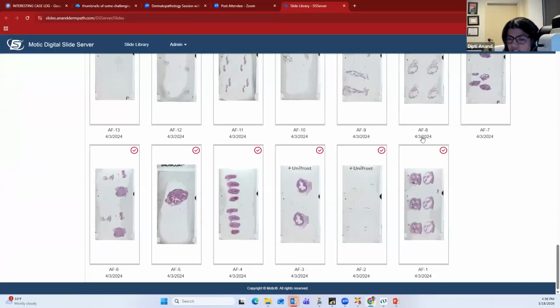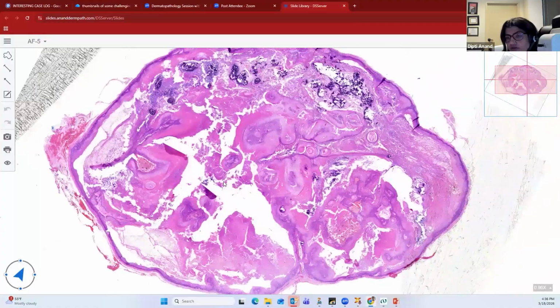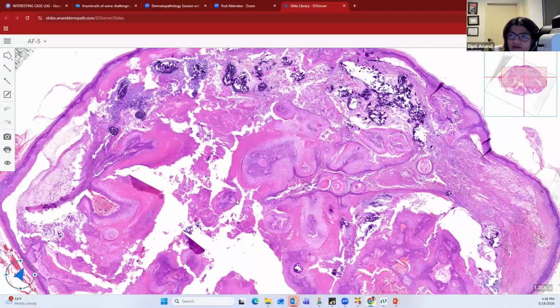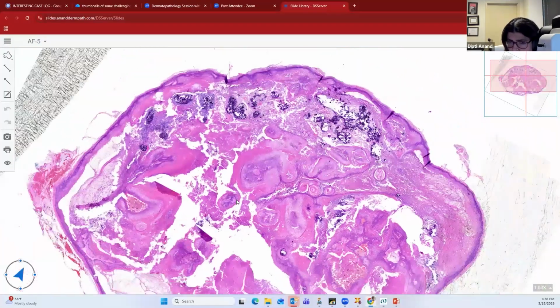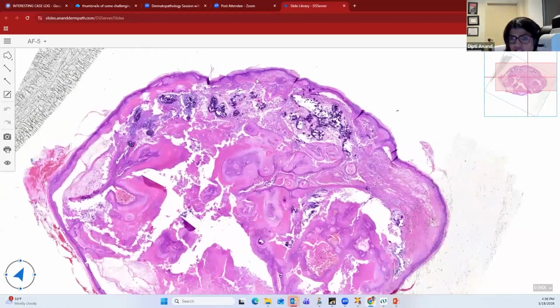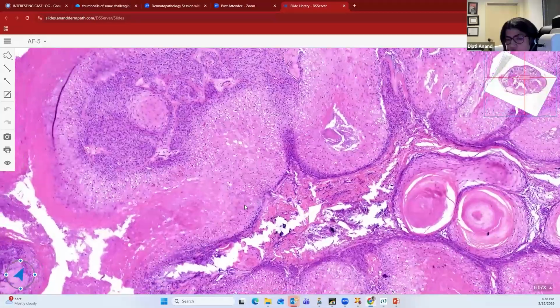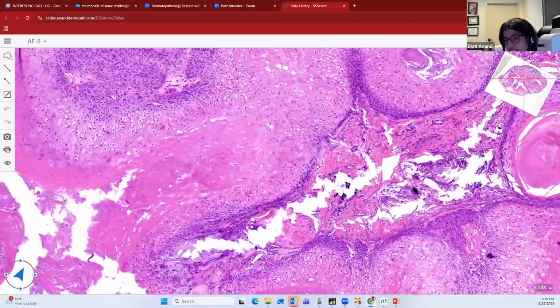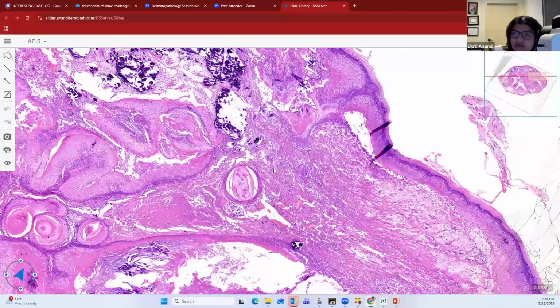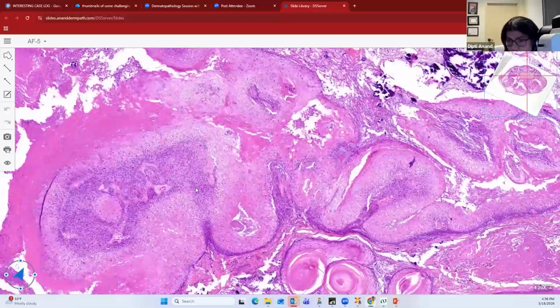An important board question is your proliferating pilar tumor. And this is often confused either with the squamous cell carcinoma or with the pilomatricoma. So you have to be careful with the pattern of keratinization, and also recognizing that the entire proliferation is confined within the cyst lumen. So you can see the well-circumscribed cystic structure, and the wall of the cyst has proliferated with this trichilemmal keratinization. So the wall is thick, but to call it malignant, you have to see clear-cut invasion into the stroma or presence of tumor necrosis.